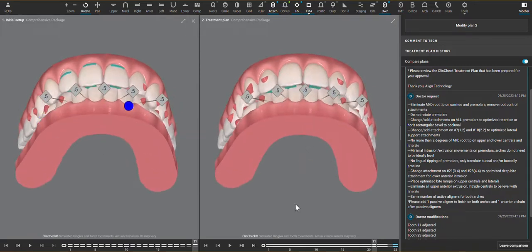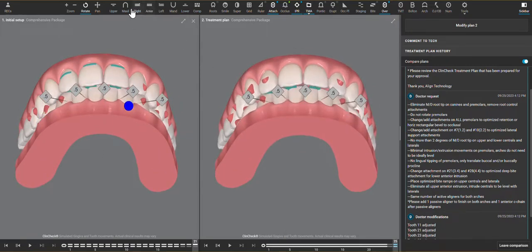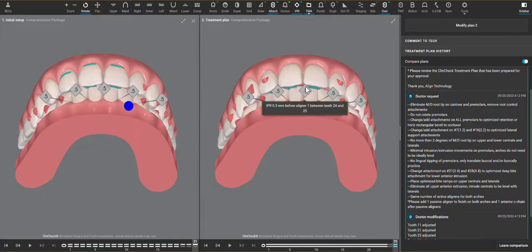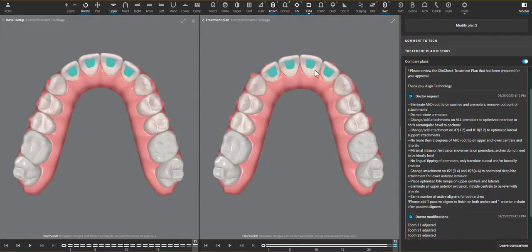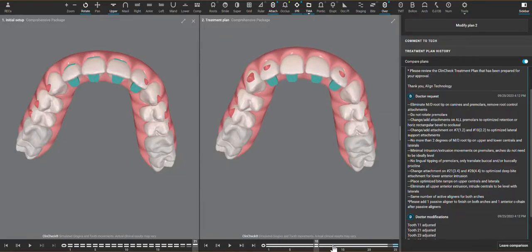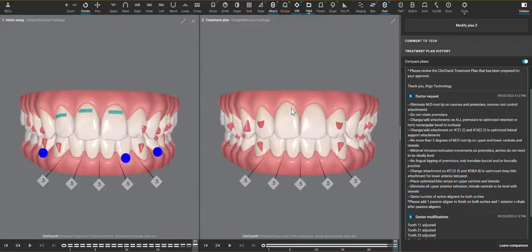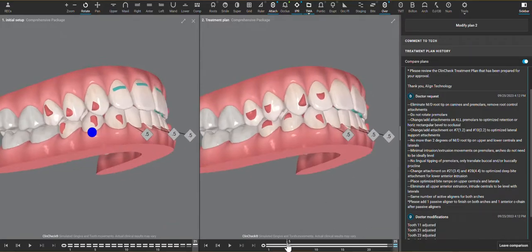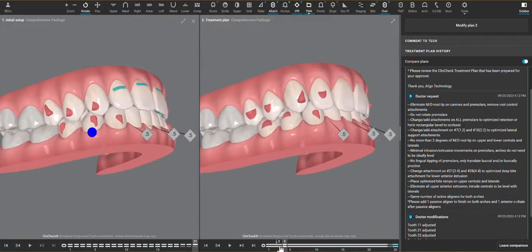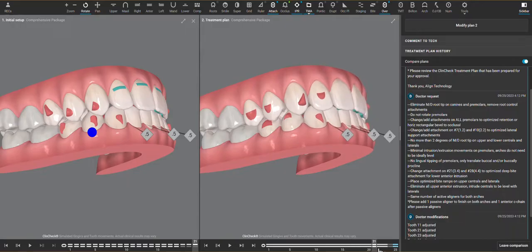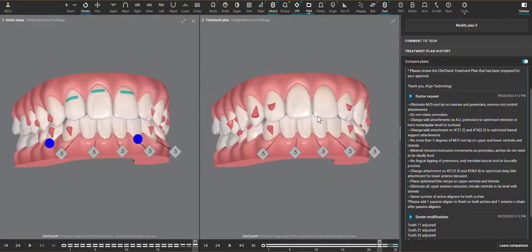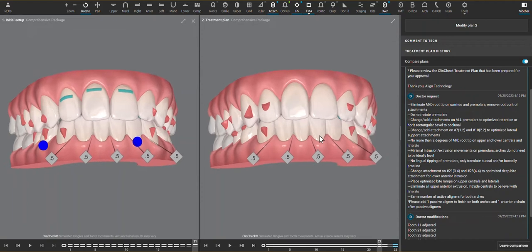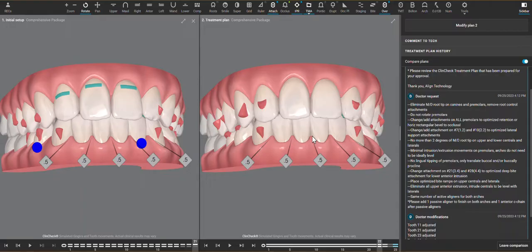I also like the inclusion of bite ramps. Bite ramps are protrusions in the aligners that show up as teal on the ClinCheck. They are there to do two main features here. Number one is to help with what the aligner is trying to do as far as upper and lower anterior intrusion. The bite ramps do not cause intrusion, but they allow the patient's own bite force to put an external force to help where the aligner is trying to go. Because intrusion is a movement that isn't complicated, but it is one where the teeth are moving into bone and there is some resistance.